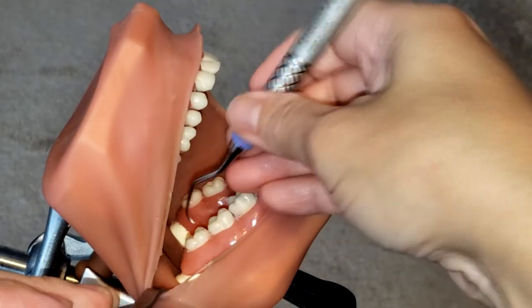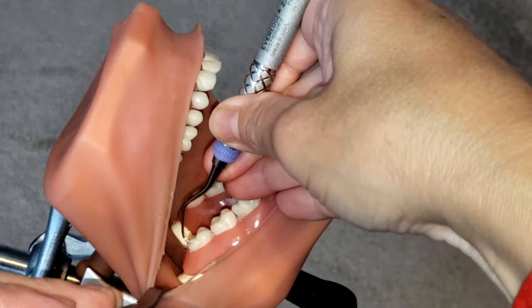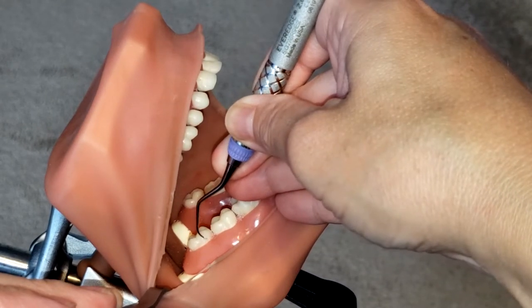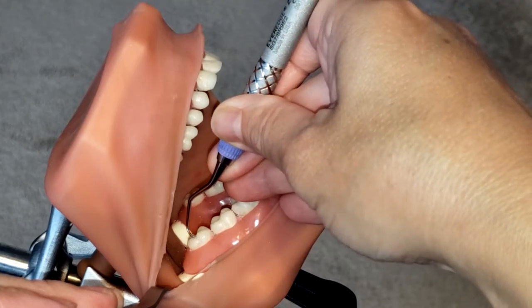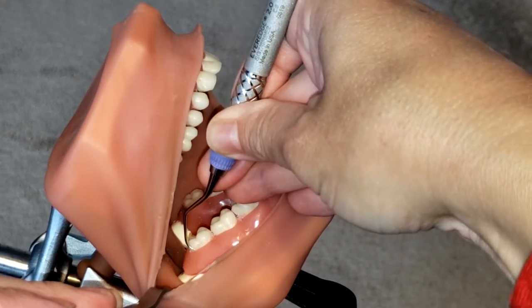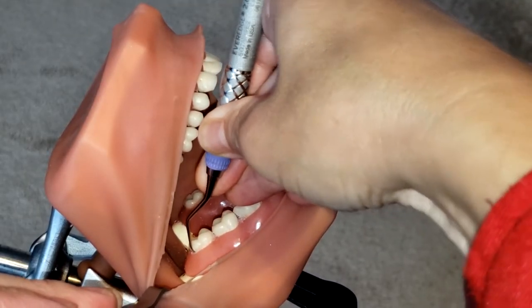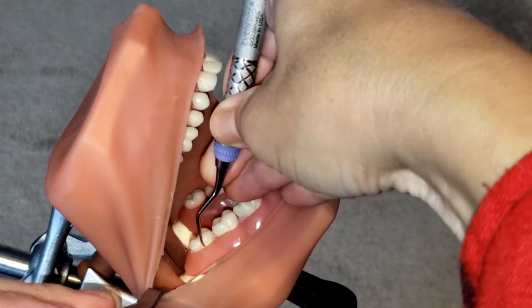Now that I've established my correct working end, I am going to start from the distal line angle and work my way towards the mesial line angle. Remember, this instrument is designed for the buccal and lingual surfaces, so we're going to start at the distal line angle and work our way into the sulcus and come across the buccal.